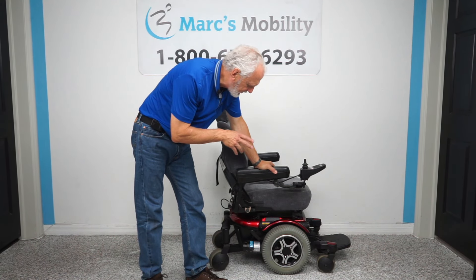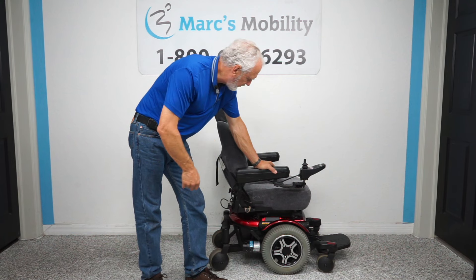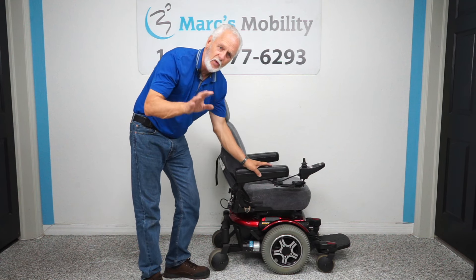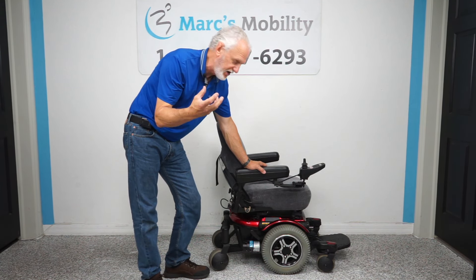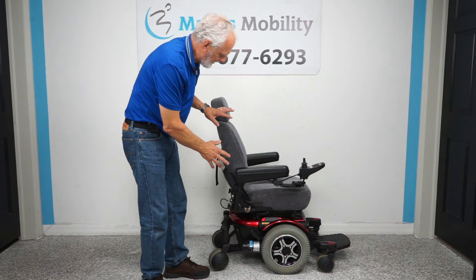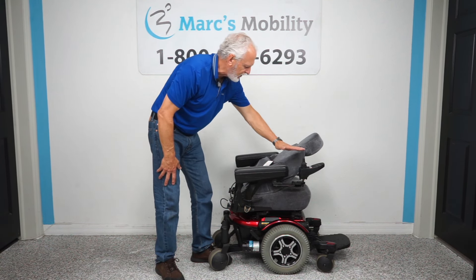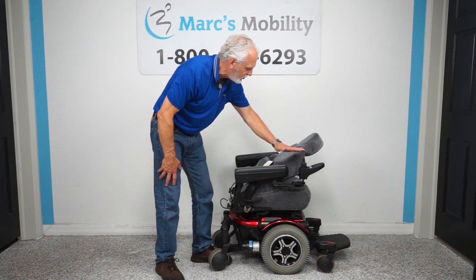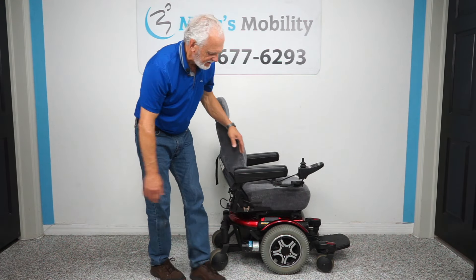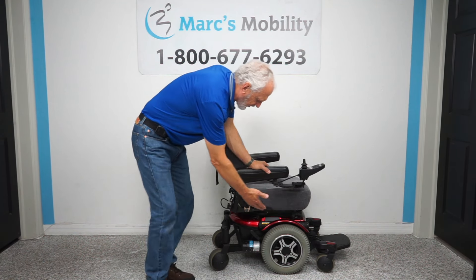Alright folks, we have here what's called a Quantum 600e. This is an older model with really good motors. What's nice about this chair is it has a cloth seat — if you have a cloth sofa at home, you know how comfortable they are; it's the same thing with this seat. This is a captain seat, meaning you can fold the seat down. Your height point is about 32 inches if you're going to transport this in the back of your minivan — 32 inches without the headrest. This chair has six wheels on the ground, great suspension, and solid 14-inch tires.